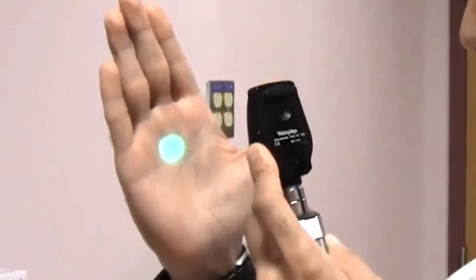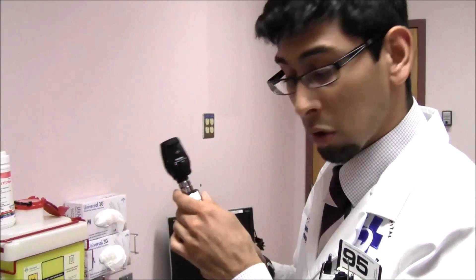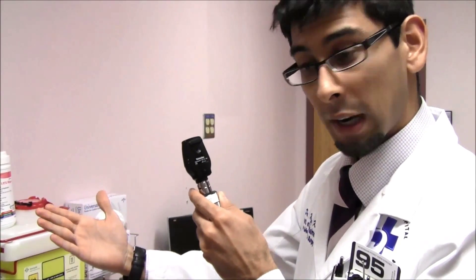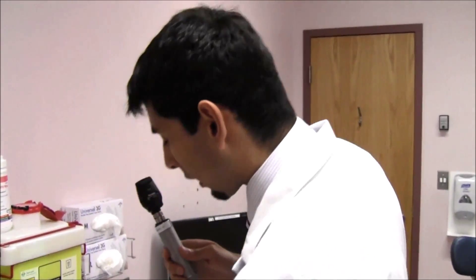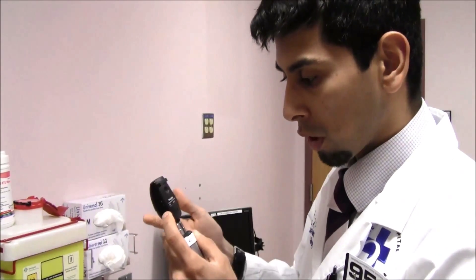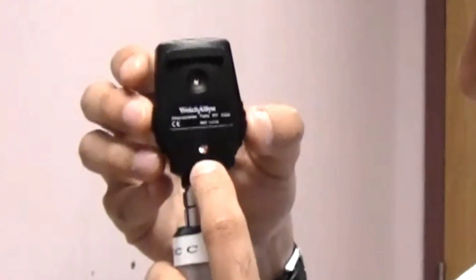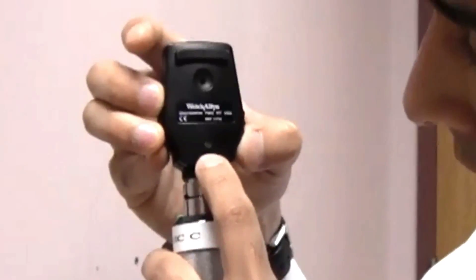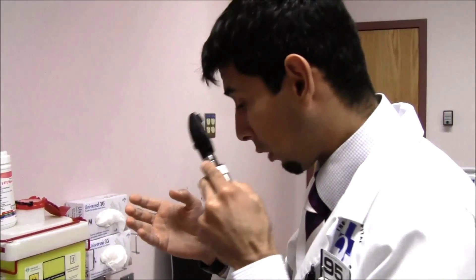The knob on this side is used to change the refractive power of the direct ophthalmoscope. If you keep your spectacles on, you can start at zero, assuming that the patient you're going to be examining also has no refractive error. If you take your spectacles off, then you need to dial in what your prescription was. In my case, it's minus five. There's a little number that's illuminated — if the light turns red, it's negative prescription; if the light turns green, it's positive prescription. So I would dial in minus five, and then I would start my refraction.